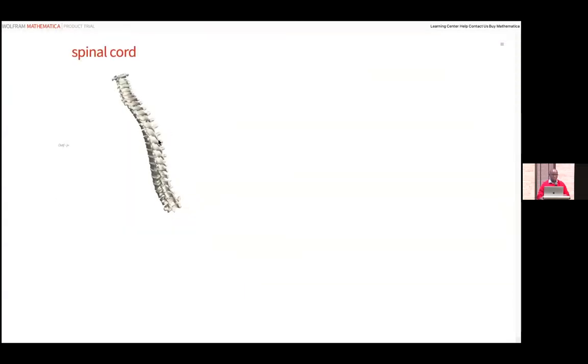This is my vertebral column. And before I tell you to do a spinal, I just need to tell you that maybe the orientation of your spinous processes is different at different regions of the body. So you take this first year anesthesia resident or first year student from KMTC, and you tell him to poke the patient for the first time. I thought this will make the operating room a little less unpleasant.